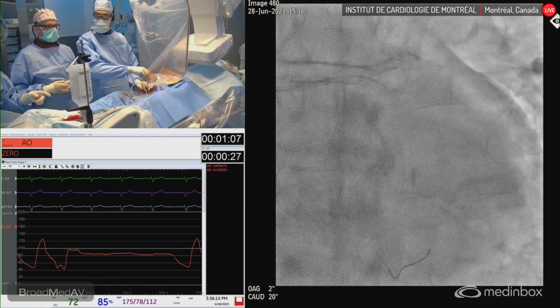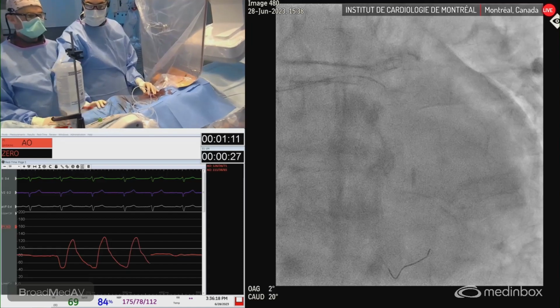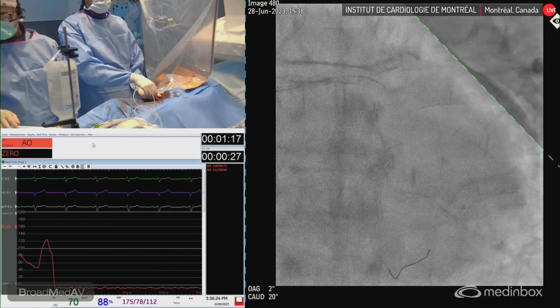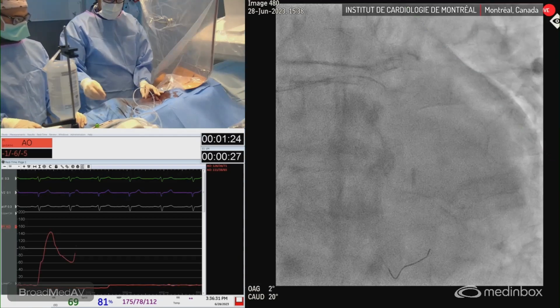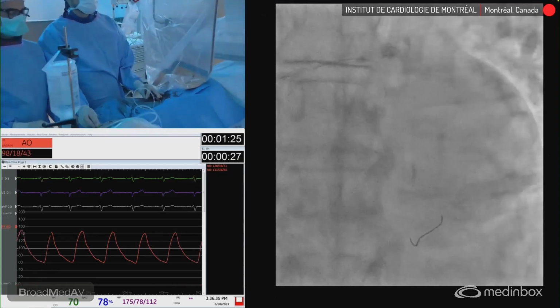Okay, so we'll do another run of Diamondback. Yeah, I'll do one. Prepare the stent. We'll take a picture to find out the length and the size of the stent. So I think after that, once it's time to implant that stent, maybe we'll put the 2 wires in the marginal and the LAD just to make sure that we have access to the vessels. Plus distal.